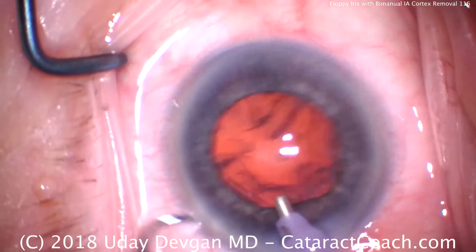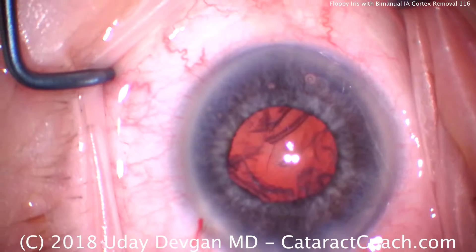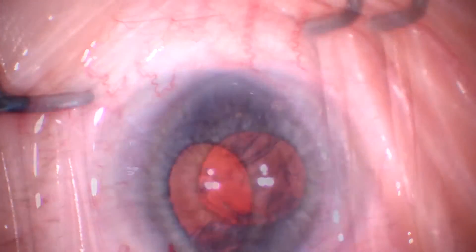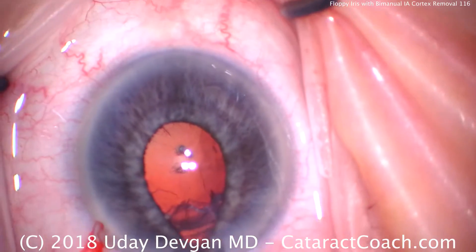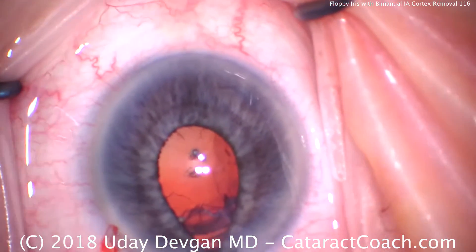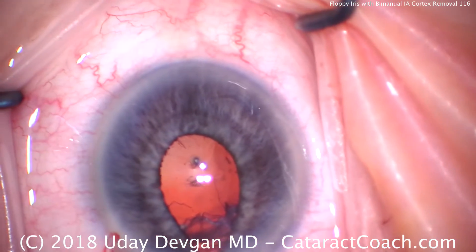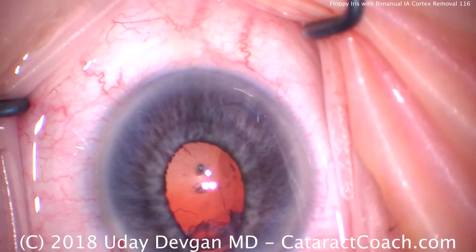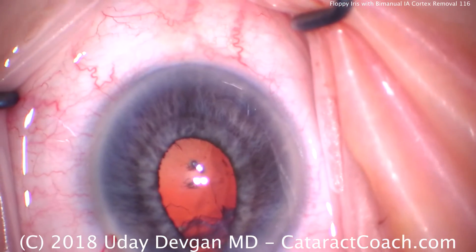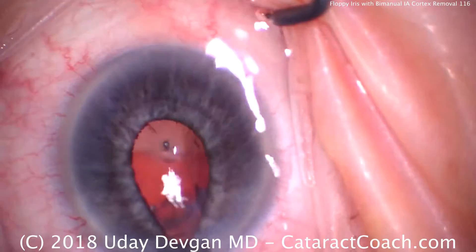Now ready for irrigation aspiration. I want to show you this special handpiece. In our right hand we'll have the infusion — we can already see some iris prolapse there. We'll put the infusion in through the main incision; it has a sleeve on it to fill up that main incision. Then through the side port we'll use the aspiration device, which will give us full 360-degree access to all of the lens cortex.